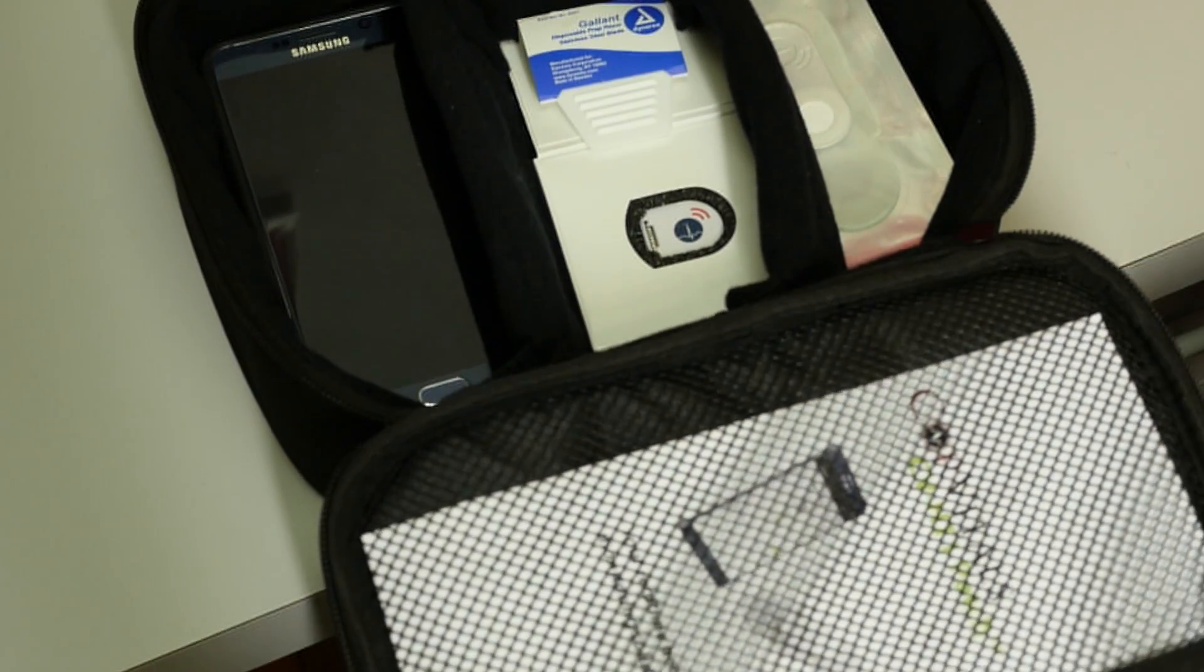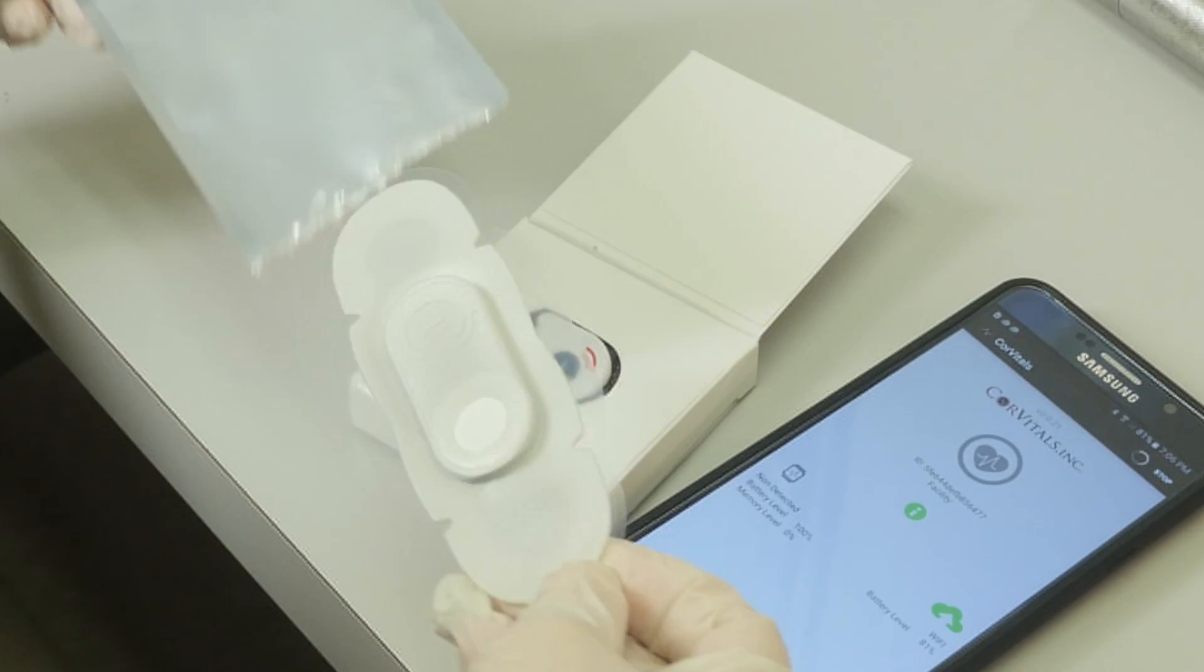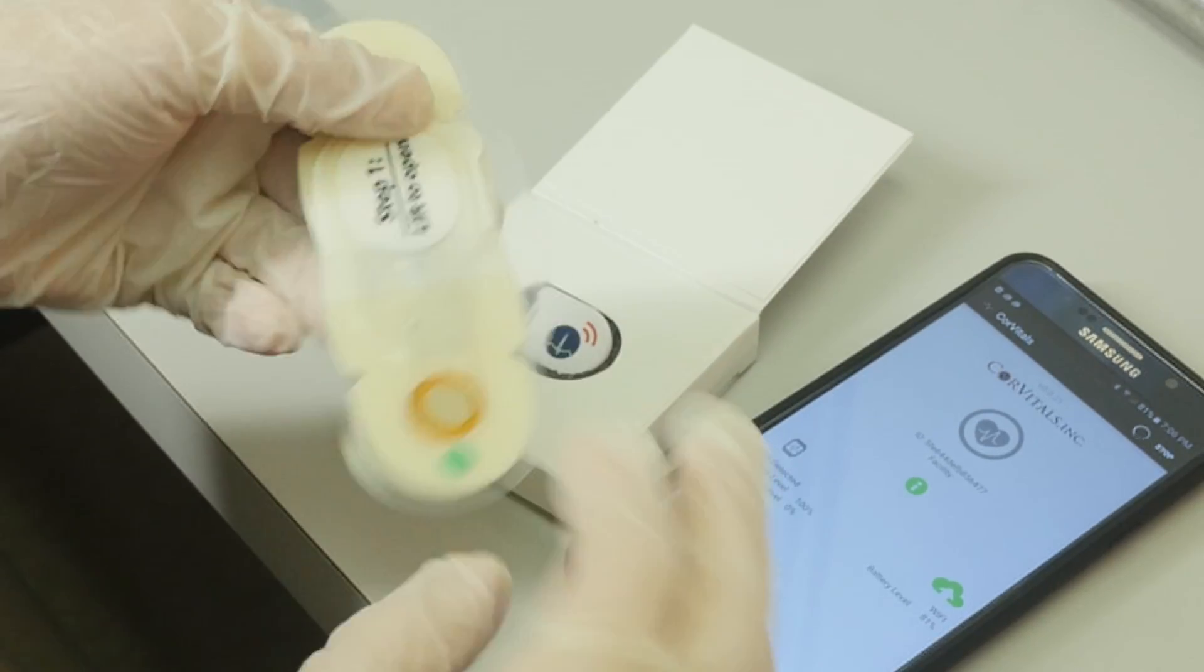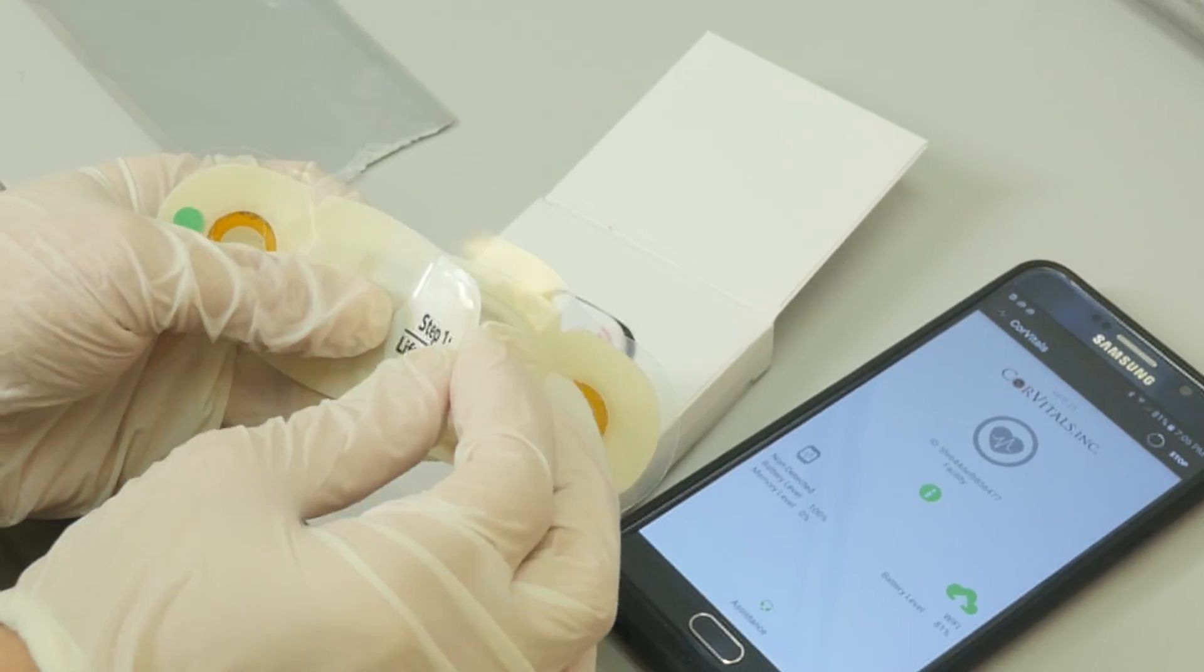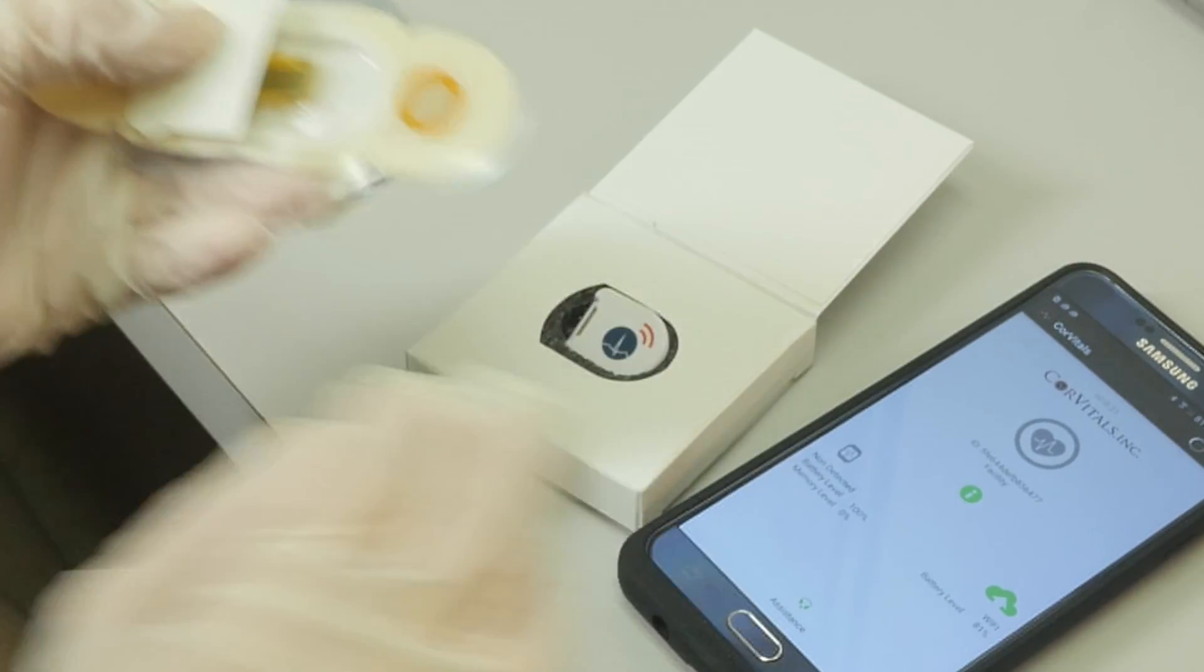Preparing the patch and module. With the adhesive side of the patch facing you, gently lift the flap. Be careful not to touch the adhesive strip.